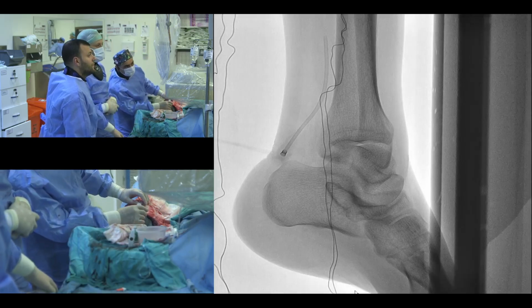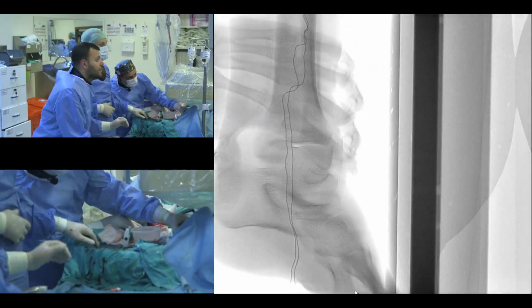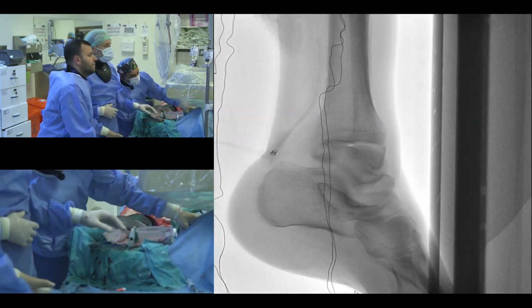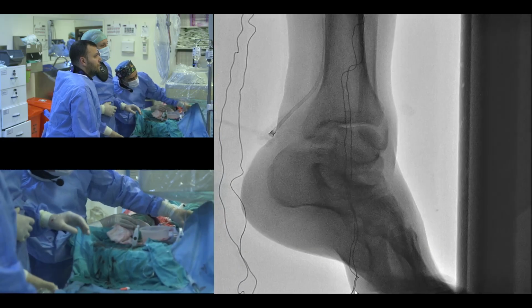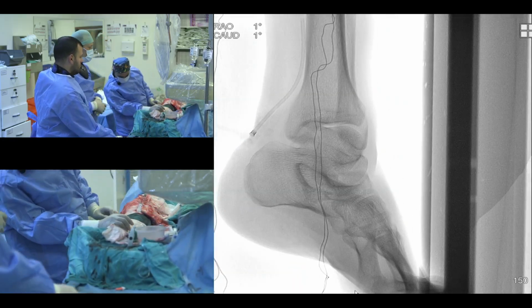I am not sure. Because of that, I try to cross retrograde to the peroneal artery, but I think the balloon will not cross that. Yılmaz, can you show us conventional angiography?